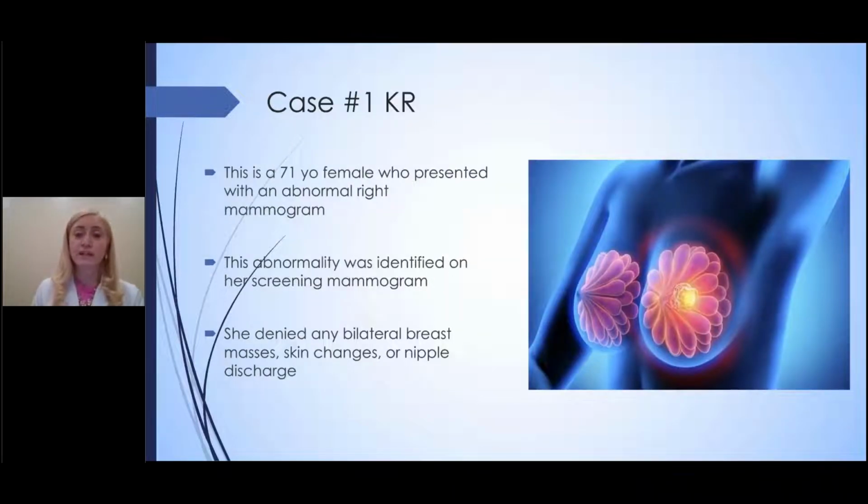So we'll go through a couple of cases where the Mozart was used and just discuss those specimens and the images. Our first case is KR. This is a 71-year-old female. She had presented with an abnormal right mammogram. The abnormality was identified through her screening imaging. She had denied any bilateral breast masses, any skin changes, or nipple discharge.